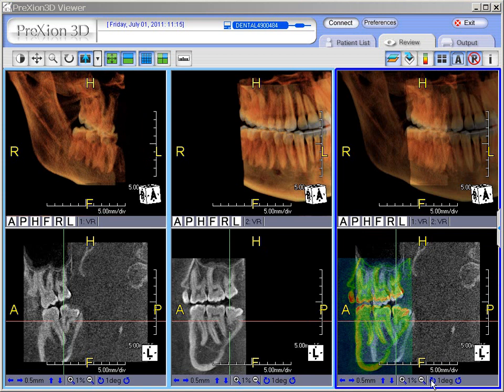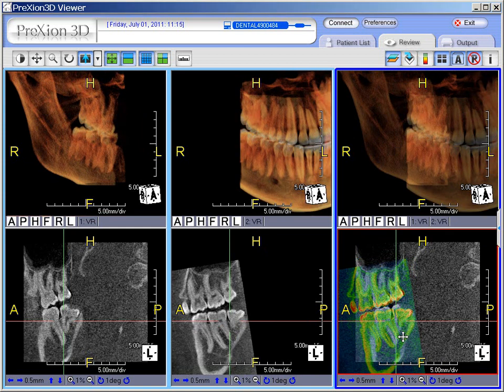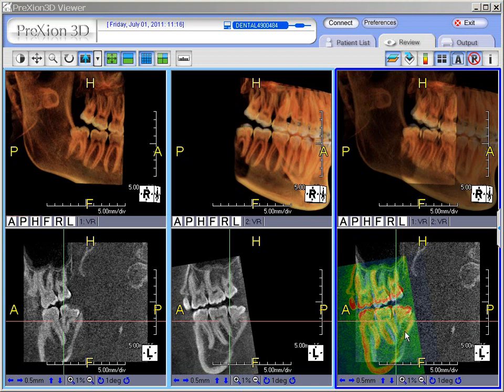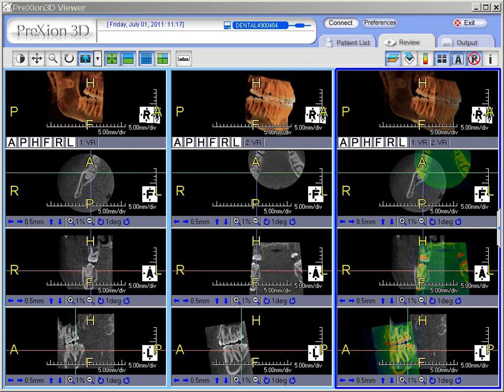Here in the sagittal plane, we'll quickly demonstrate the one-degree angle motion as we click and get a better alignment. You can always right-click again, reset, and make adjustments to align both the upper and lower dentition and apply the necessary adjustments. Don't forget the 3D image — one can use that as reference as one makes adjustments and can see how the 3D gets better aligned. Please use your 3D image in the assessment of all three MPR views plus the 3D. We are evaluating back and forth between all the views and different slices to be fairly certain that we have a good alignment set before we do our stitch procedure.